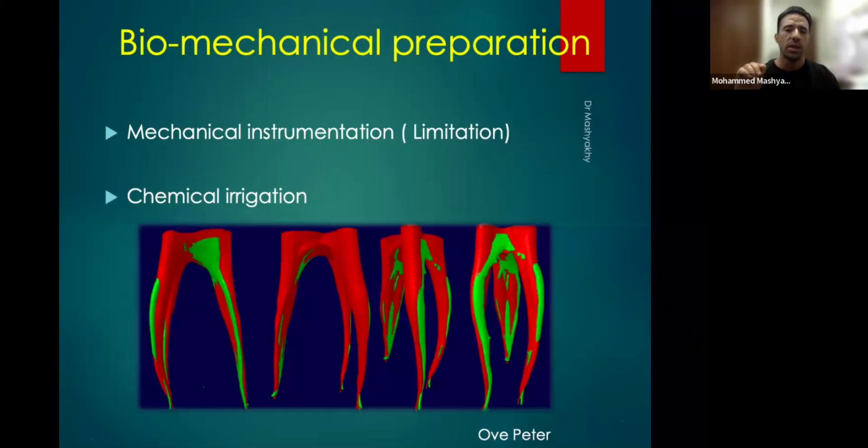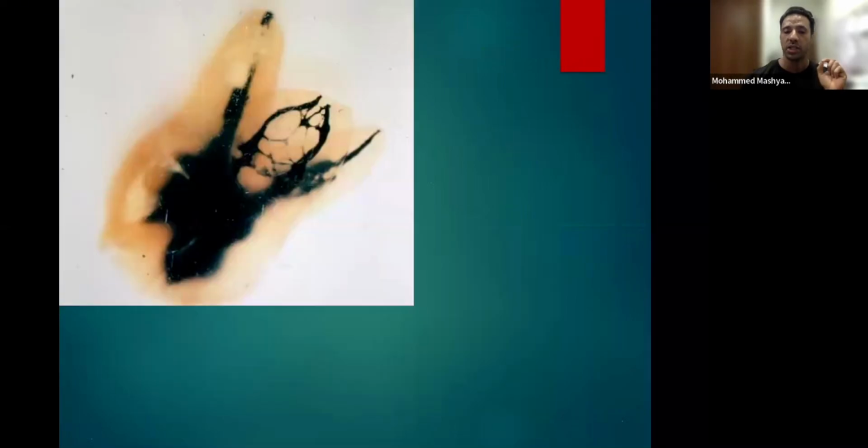So you clean, you do whatever you think you are doing, then there is a lot of root canal system anatomy inside that is not touched. And that place you don't touch, what happened? The places you are touching, you're cutting dentin and debris or whatever, and you pack it on that side. So put this in your mind. It's very important to have chemical irrigation.